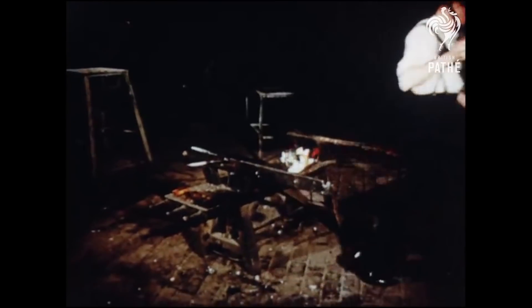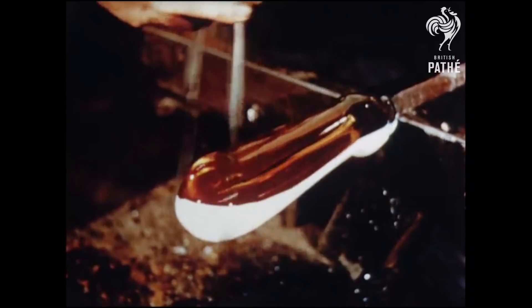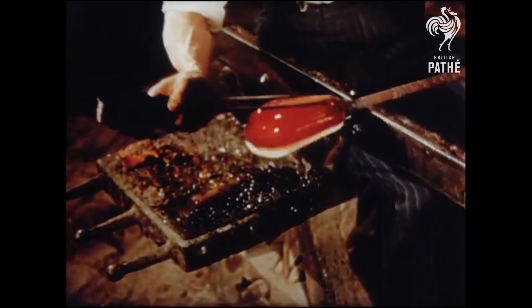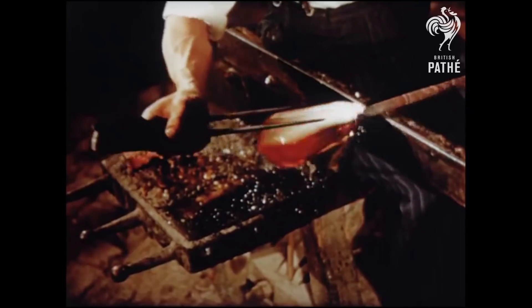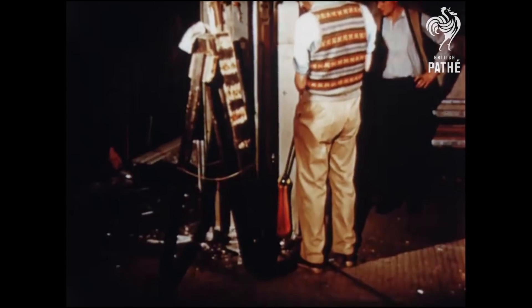The blob of glass is now shaped and checked with calipers, to ensure that a uniform thickness has been kept along the stretched glass. Only a second or two remains in which to pull out the glass even further, into lengths of about five feet. Each of these lengths will later make over a hundred feet of thermometer tubing.